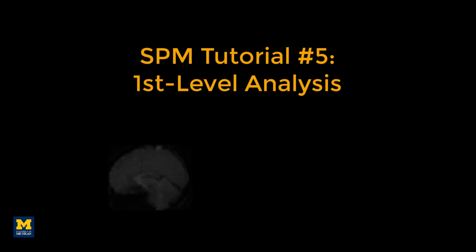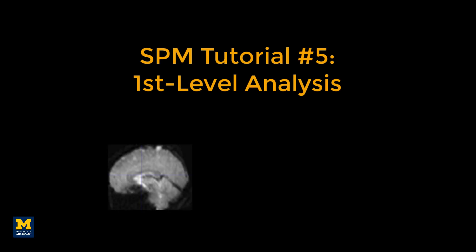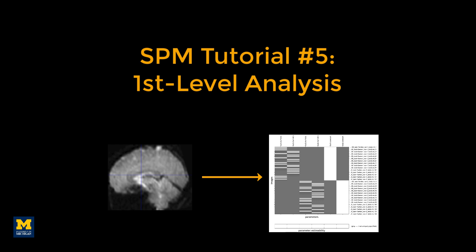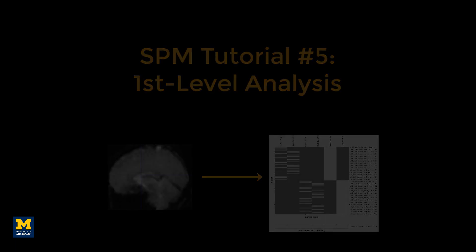After we've pre-processed our data, we then need to fit a model to it. In other words, we will estimate how much BOLD activity there was for each condition in each voxel in the brain.